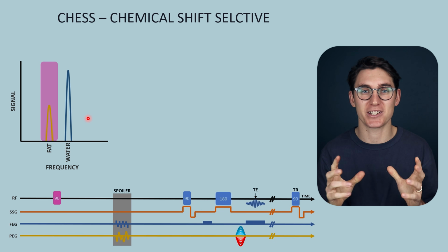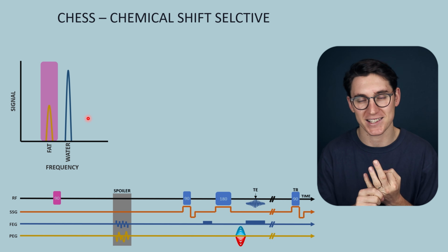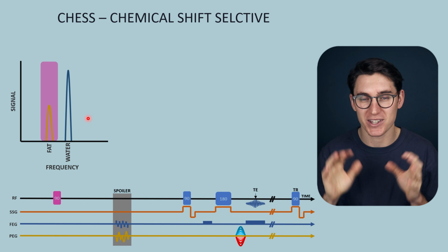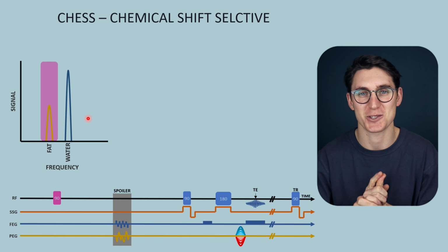Now, this is a great question that comes up in exams. There are actually three main mechanisms to null signal coming from fat, and we go through that extensively within the question bank that I've linked below. We are still going to look at the last mechanism within these lectures of reducing signal coming from fat. That's coming up in a later talk.